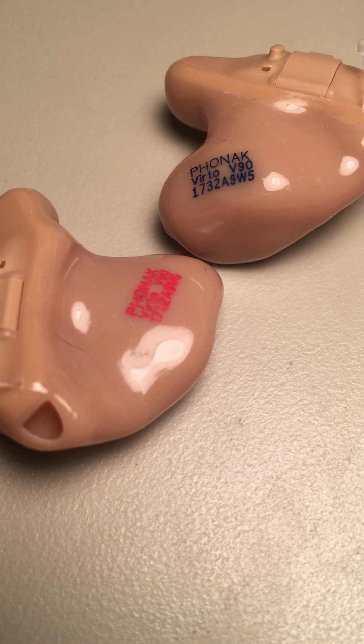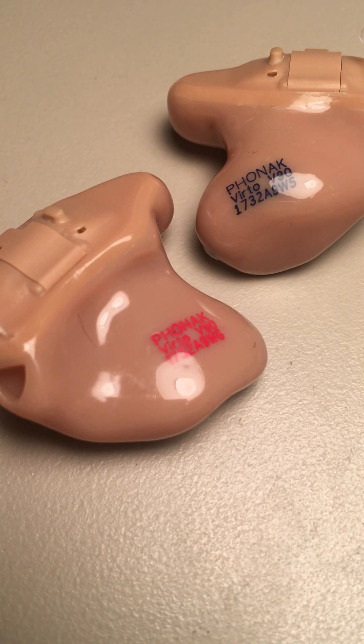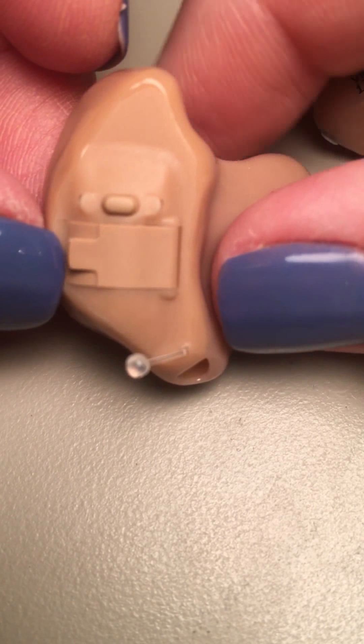Here we have a couple of different hearing aids. These are called in-the-ear hearing aids. If you look at the colors on the writing, you'll see that one is red and one is blue. The right one will always be red, and the left one is going to be blue.